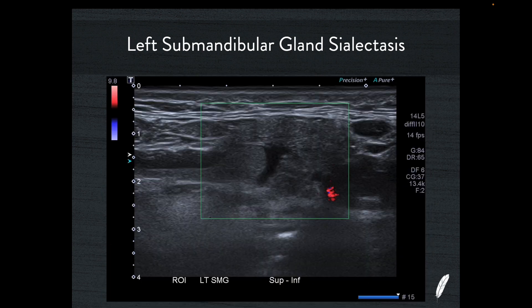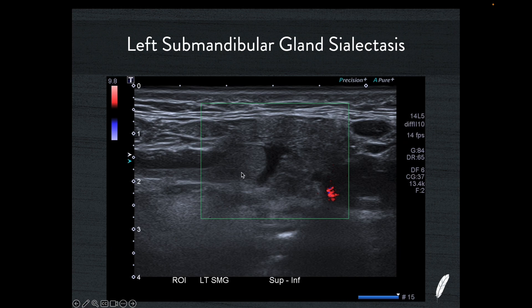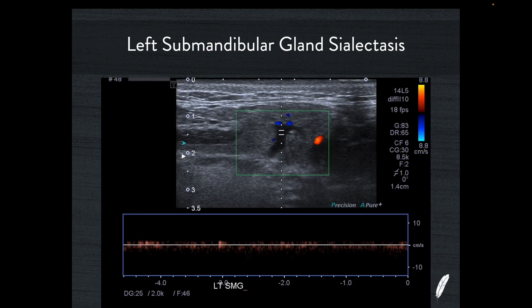Sometimes this appearance can be because of a vessel passing through the submandibular gland, so make sure you put Doppler on. With color Doppler on and a fairly low pulse repetition frequency of 9.8, you can see there's actually no flow inside this tube, making me think this is part of the collecting system. Pulse wave confirms there's just a little bit of noise clutter around the baseline — there's no way this is a vein or an artery passing through.